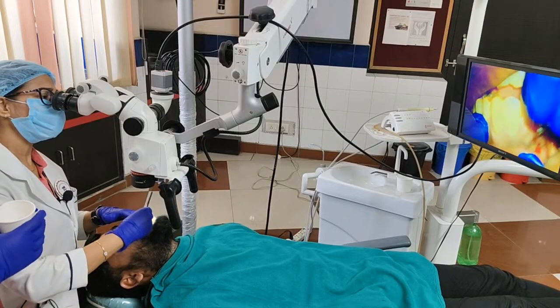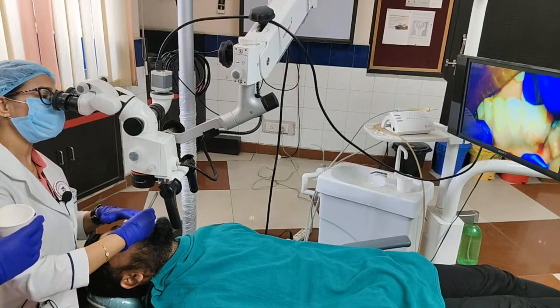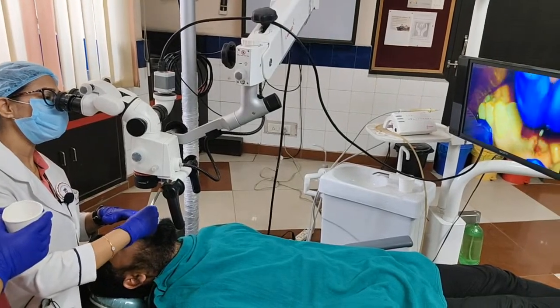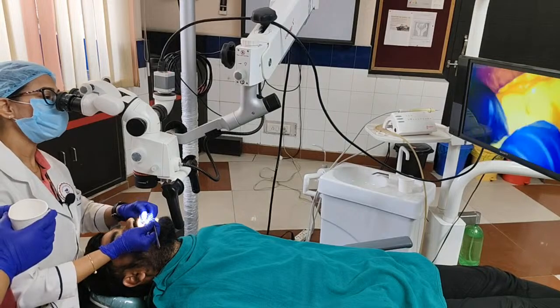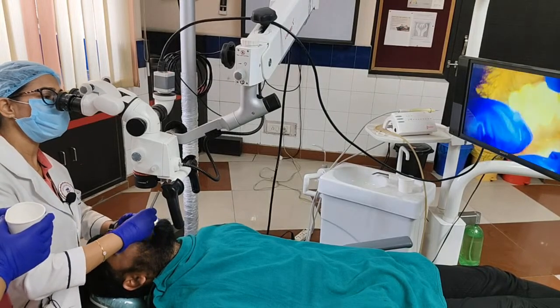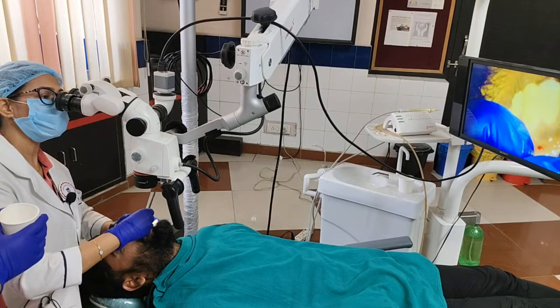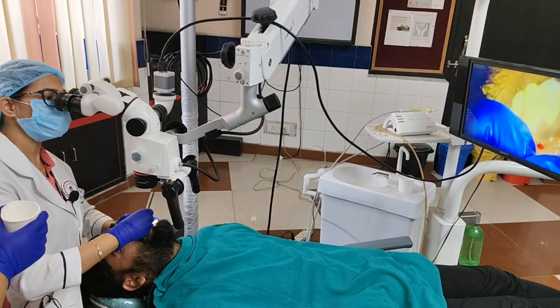So, the melanocytes are basically present in your basal layer of the epithelium. So what we are going to do is strip away that epithelium that has those melanocytes. Now, something we have to be very careful about while we do this depigmentation procedure is that we make sure we are in the epithelial layer only. Maybe probably a very light layer of the connective tissue.